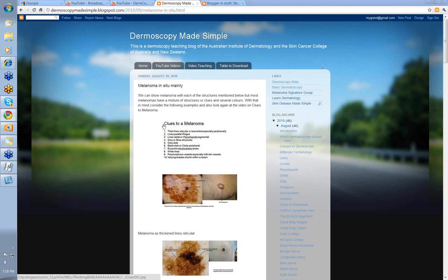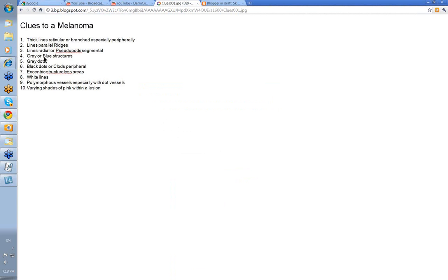First of all, the clues to melanoma. Let's just go over them again. Thick lines reticular or branched especially peripherally, lines parallel ridges, lines radial or pseudopod segmental, gray or blue structures, gray dots, black dots or clods peripheral, eccentric structureless, white lines, polymorphous vessels with some dot vessels in varying shades of pink within a lesion.